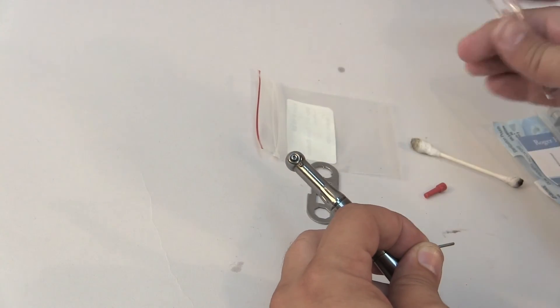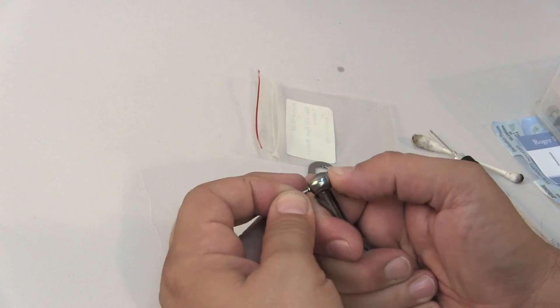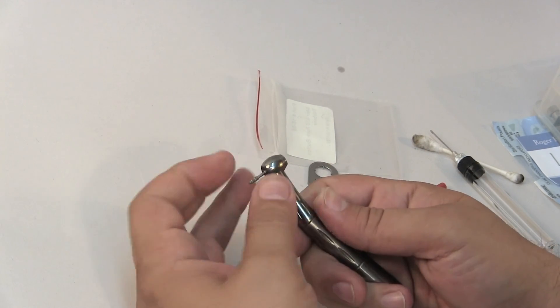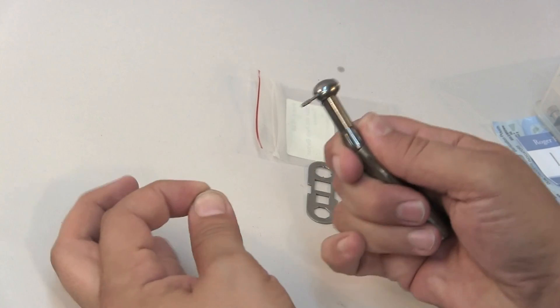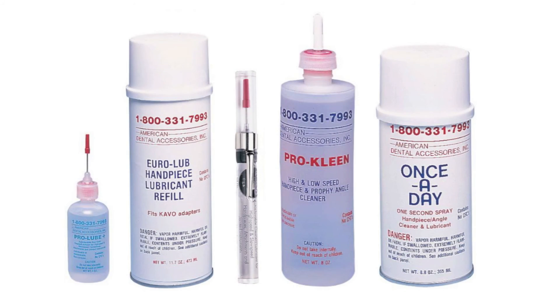It's also important to note that with lube-free turbines, the bearings are sealed so they will not require lubrication. However, debris can still enter the turbine cavity and interfere with the turbine components. We recommend using a handpiece cleaner to flush the handpiece after each use.